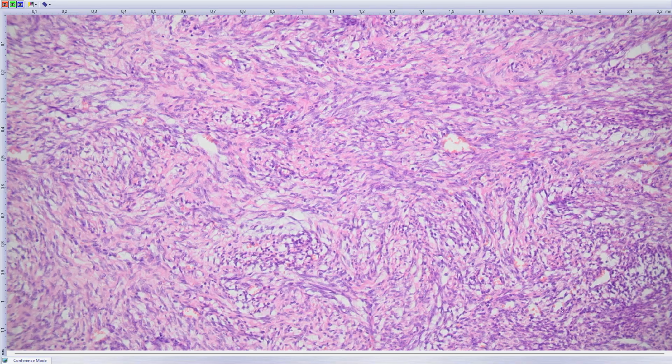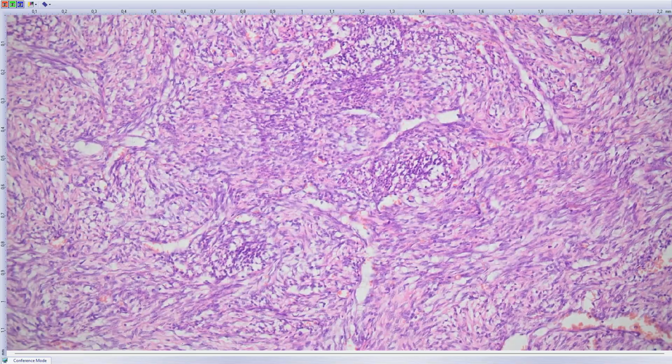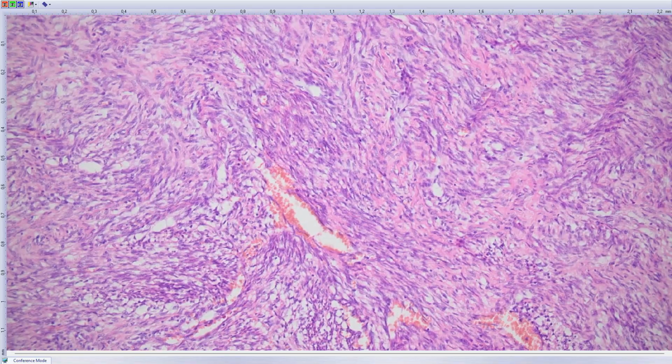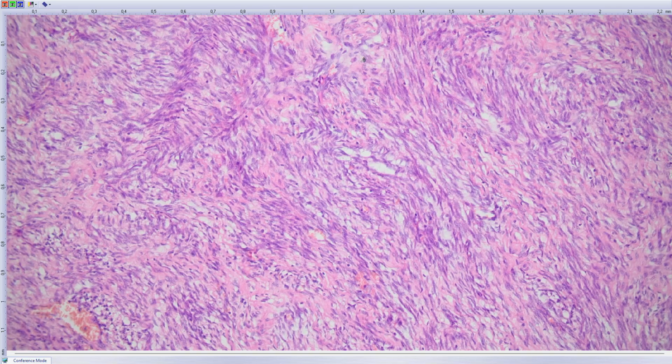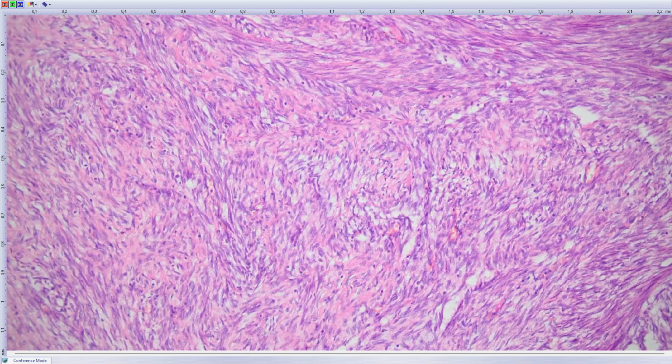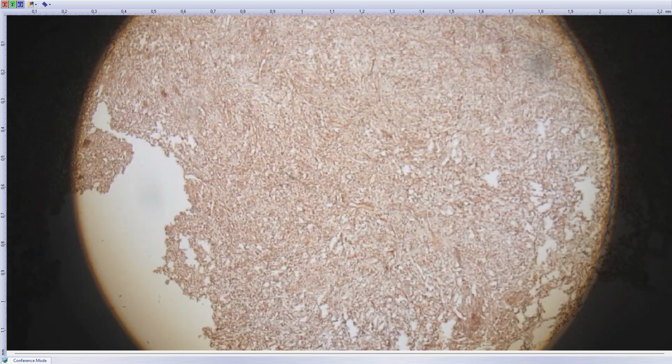And we are in the sinonasal region, and there is one particular lesion quite commonly present there. Although the entity is still quite new, I believe we've got maybe 20 cases right now here in our department. And the clue to the diagnosis is, of course, immunohistochemistry, and the lesion is diffusely positive for S100 protein.